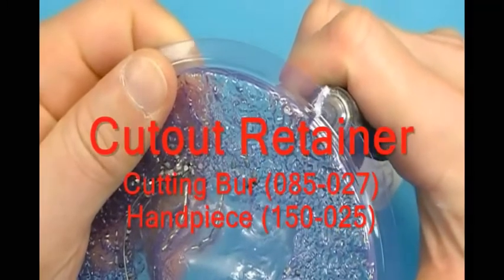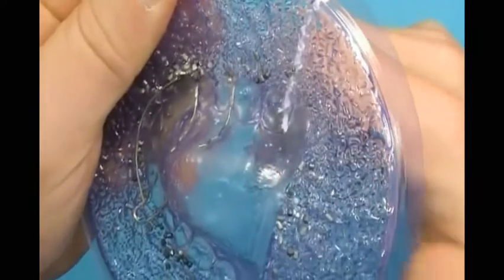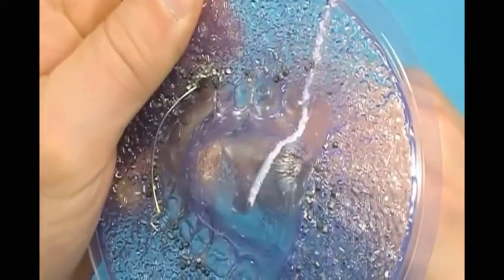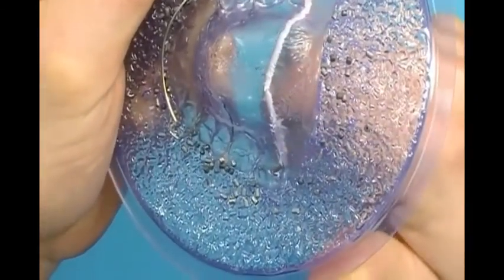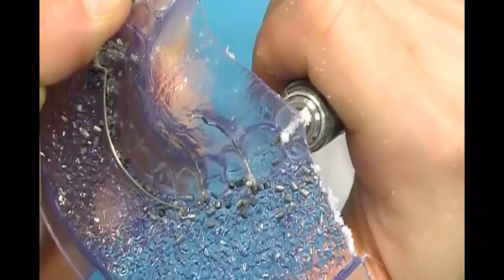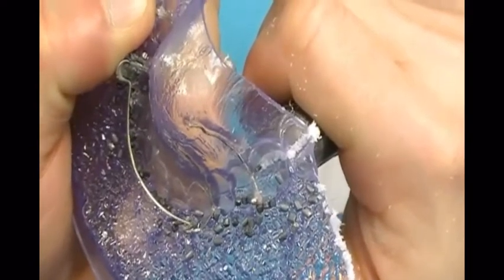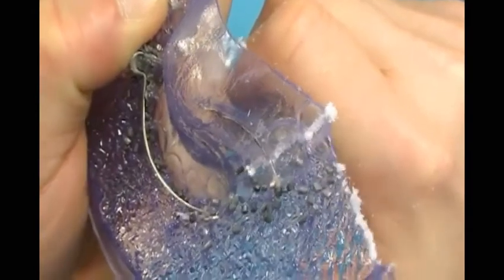Using a carbide cutting bur and lab handpiece, cut out the retainer from the disc. Start by cutting along the back of the appliance at the first or second molar reference. Then cut along the lingual cusps of the posterior teeth and near the incisal edges of the anteriors. Caution must be used around wires that are embedded in plastic.